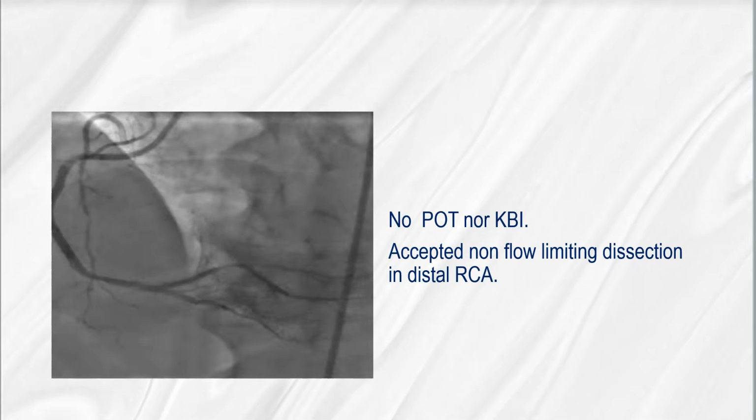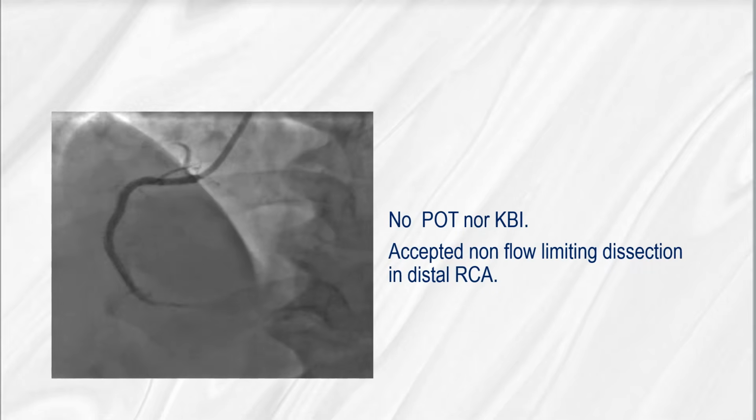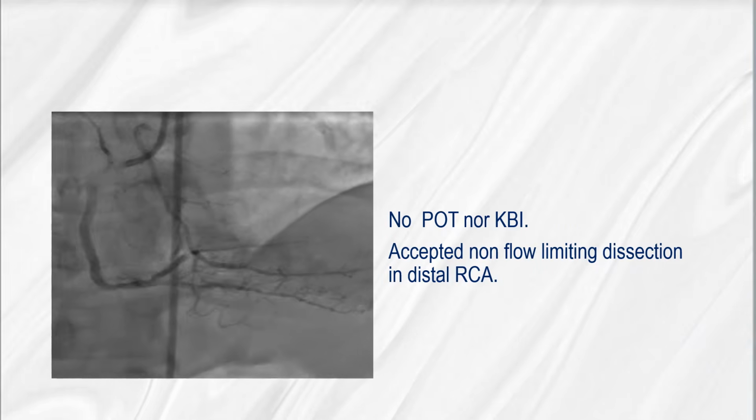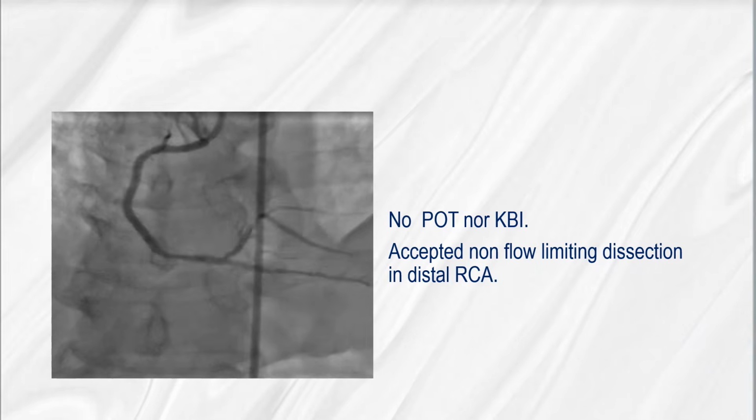And this is the final result. Accepted non-flow limiting dissection in the distal RCA. No POT nor kissing balloon inflations were done.